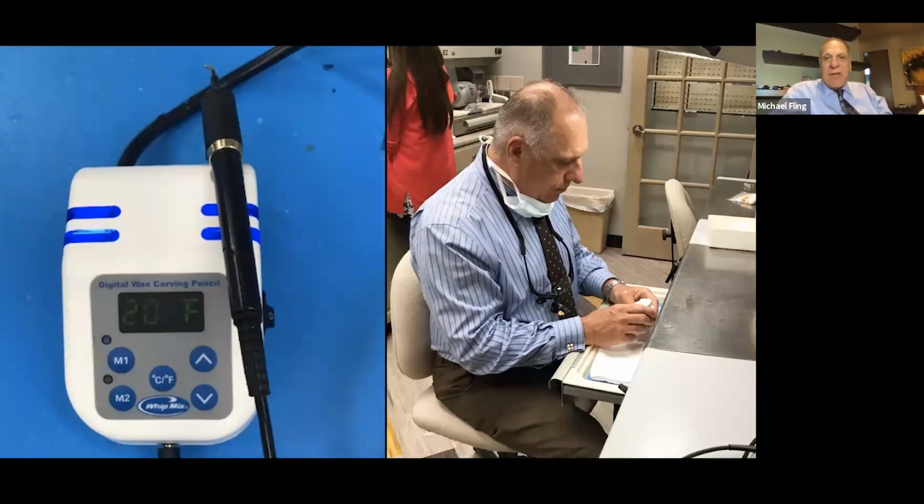In my lab, I've got a lab bench. I think it is one of the most critical pieces of equipment in my office. I use it all the time. I just don't know how I could be a restorative dentist without it. It's nice because it's got a deal you pull out right here. It's got vacuum that's built in. It's got color corrected light. I've got compressed air. I've got my wax spatula. So they're so critical, at least for me and what I do, to have the appropriate materials and equipment to do what I do.